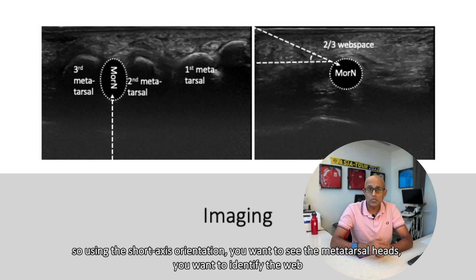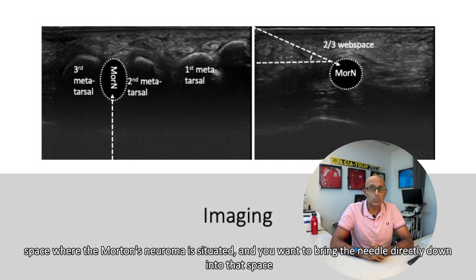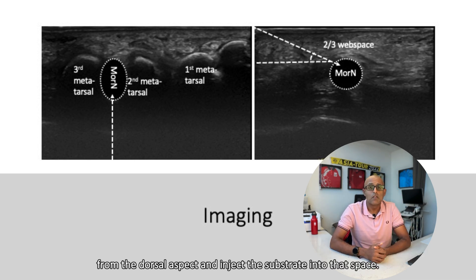Using the short axis orientation, you want to see the metatarsal heads. You want to identify the web space where the Morton's neuroma is situated, and you want to bring the needle directly down into that space from the dorsal aspect and inject the substrate into that space.